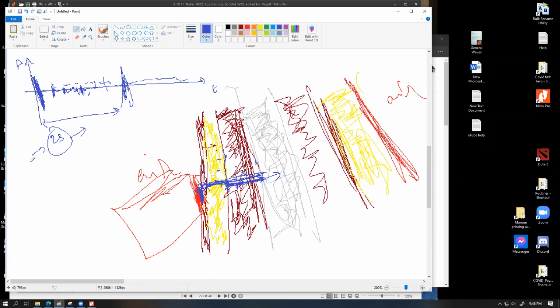Have a look. In ultrasound scanning, one single pathway for the ultrasound wave is basically a linear scan. It tells you exactly, in one dimension along the length of the path of the ultrasound, what is in that path. To produce a two-dimensional image, we have to stack up multiple of these scans, hundreds or thousands or maybe millions of these scans, for the whole region.